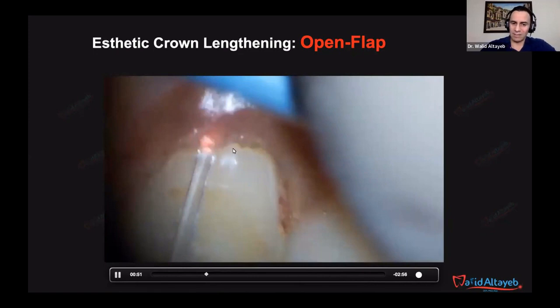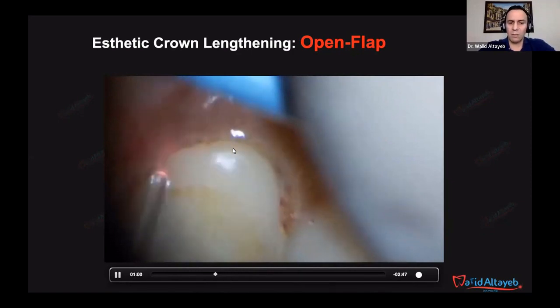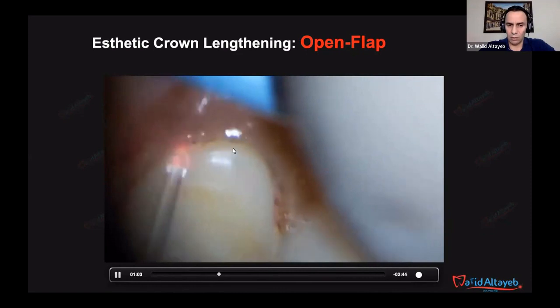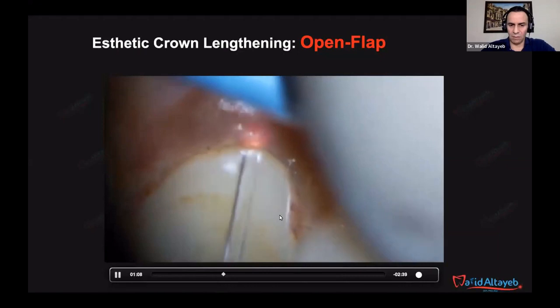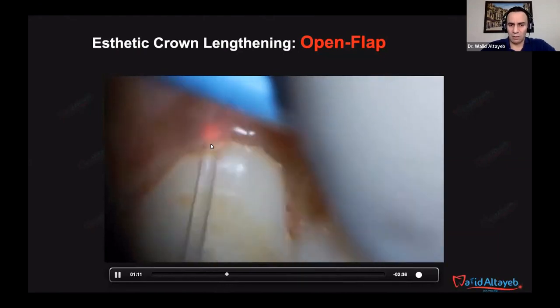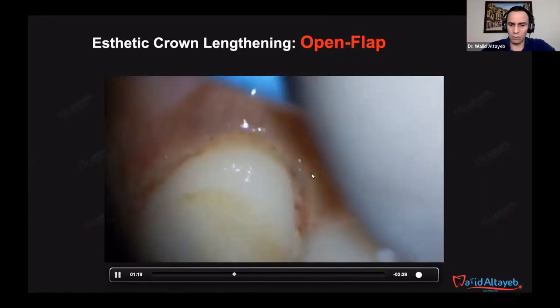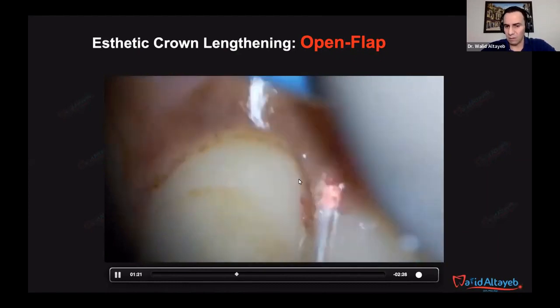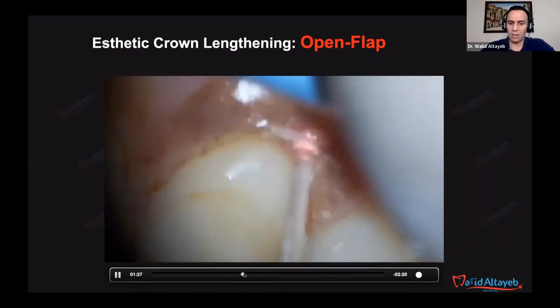We change to another, larger tip. Here we are using a 600 micron sapphire tip. We begin the gingival contouring and create the scallop of the gum, and try to finish everything before raising the flap. When you are 100% satisfied with the contour, then make the beveling to remove the ledge and any irregularity in the tissue. Now is the time for the flap.